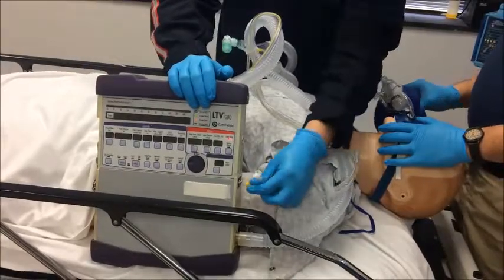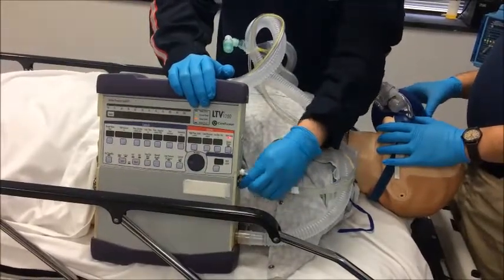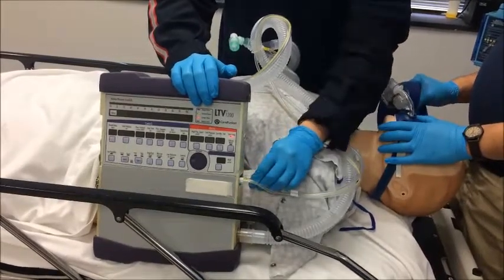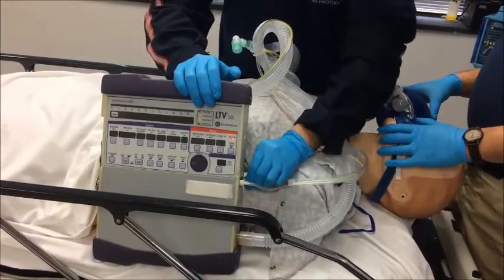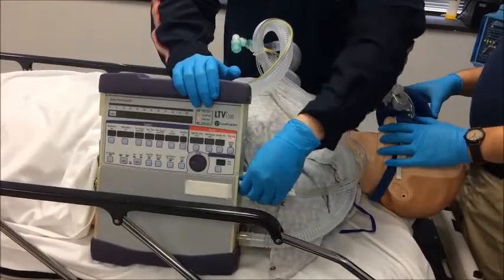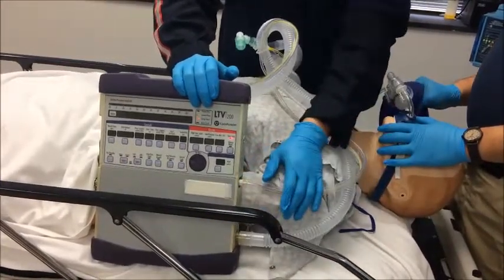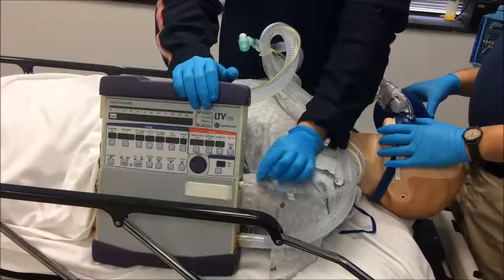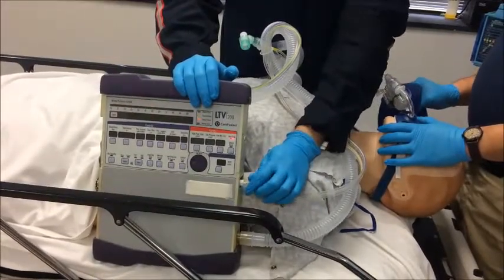So the next thing you're going to do is just connect all your pressure lines. Make sure all connections are tight and that nothing is connected loosely so it doesn't fall off, as these connect and control your PEEP valve, your pressure monitoring, and your flow sensing.